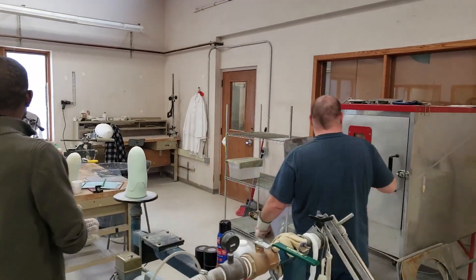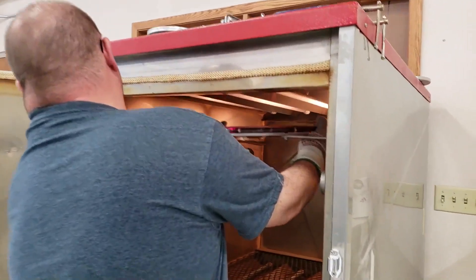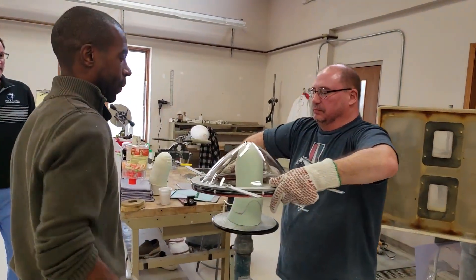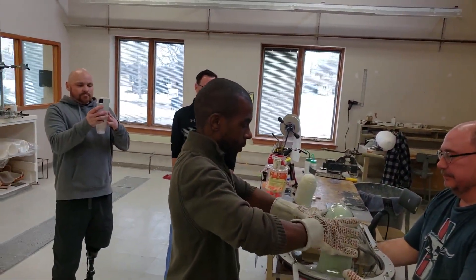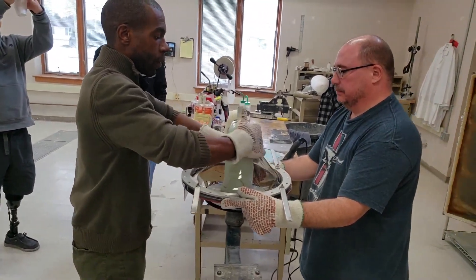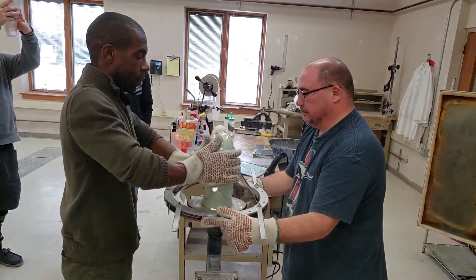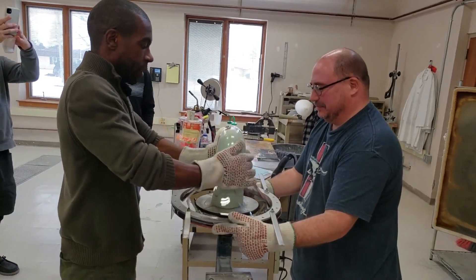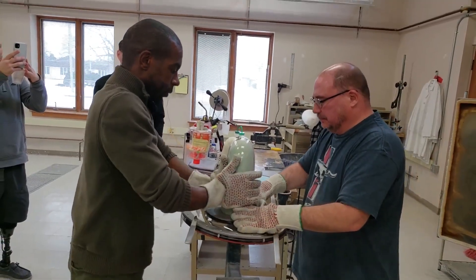Once the model is carved, it's moved to the technical room where the technicians heat up a sheet of plastic so it forms a bubble, invert the bubble over the mold, and gently manipulate the plastic down the model before engaging a vacuum. The vacuum pulls the plastic to the foam model in an airtight fashion, ensuring the exact shape created via our digital modification is captured in our first usable diagnostic prosthetic socket.